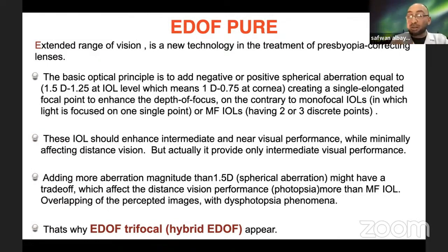In contrast to monofocal IOLs, in which light is focused on one single point, or multifocal IOLs having 2 to 3 discrete points, these IOLs should enhance the intermediate and near visual performance while minimally affecting distance vision. But actually, it provides only intermediate visual performance.